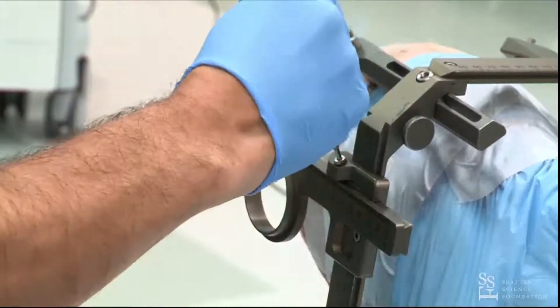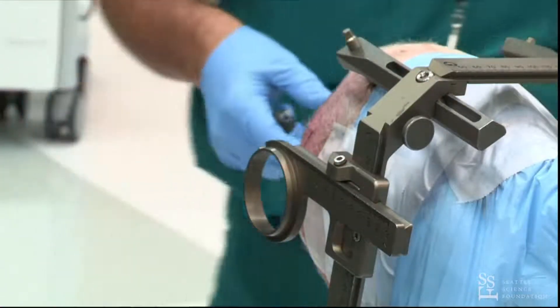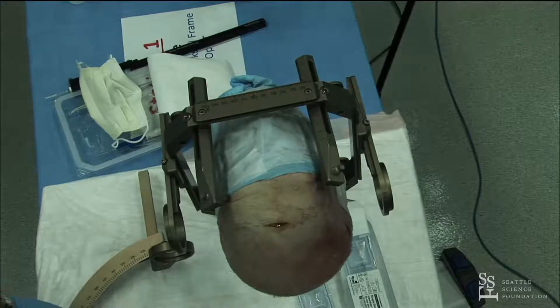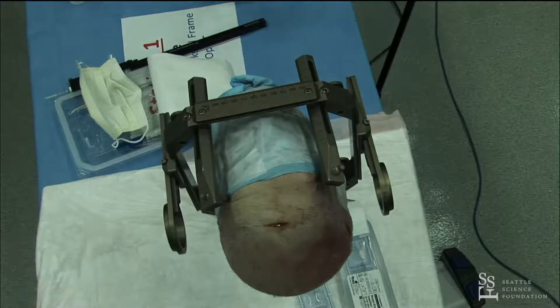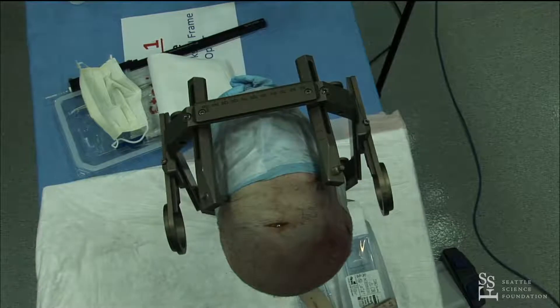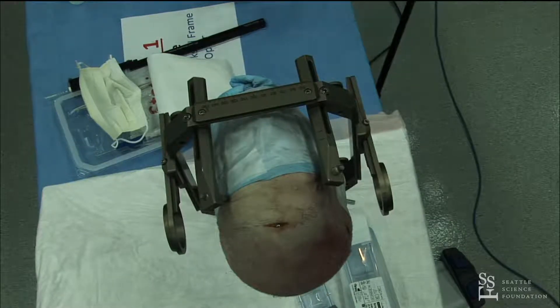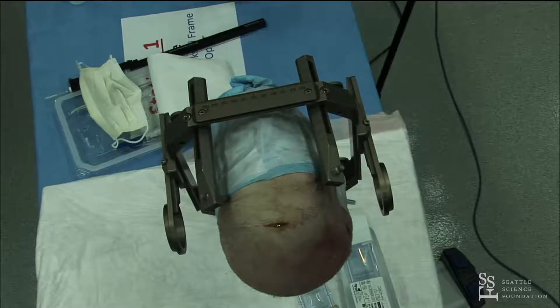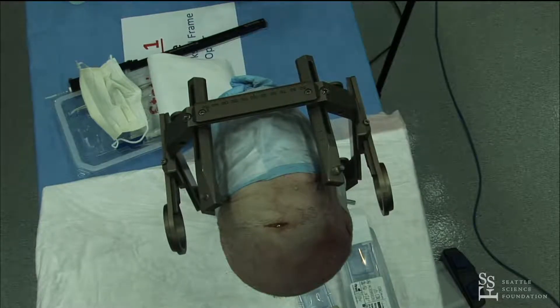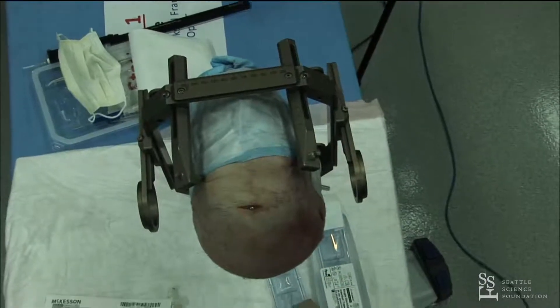In the lab, these frames always have about 0.2-millimeter error, and then in real life they're advertised for something like 3-millimeter error. So the goal is to minimize that in vivo error so it's as close as possible to what you get outside of the body. With these, if we got a scan, the dead tissue itself becomes so noncompliant that we get more errors in a cadaver than we would in a human.